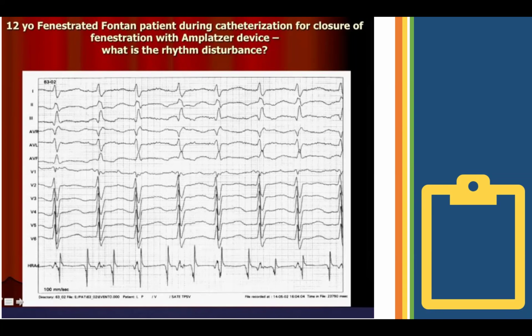So it's always a good idea. I agree with you 100%, Ivana, that looking at the 12 lead and trying to orient yourself and see if you can figure it out by the 12 lead is always a good idea. And I would encourage you that if you're taking an examination ever or standing at the bedside and someone has atrial wires, for example, I would always favor as your first test the regular 12 lead. The reason is that's the test that you and I look at the most of all tests. So you would always want to lean on the thing that you're the most experienced with, right?